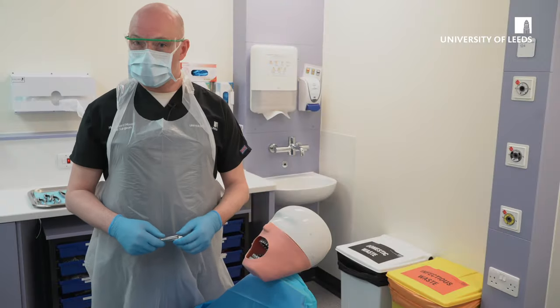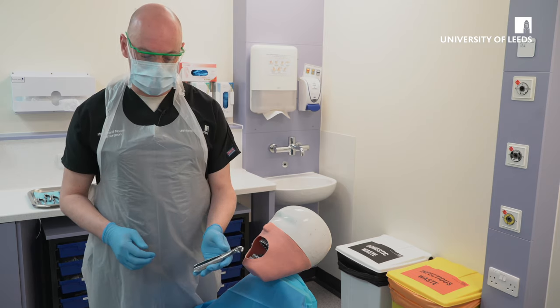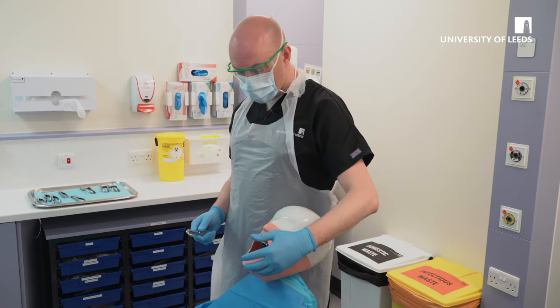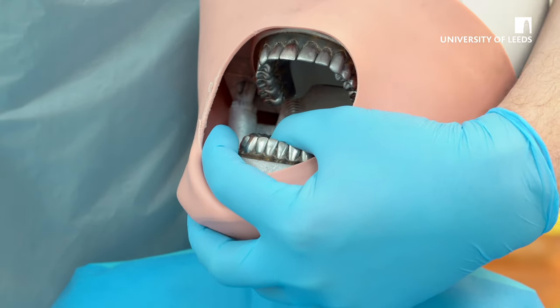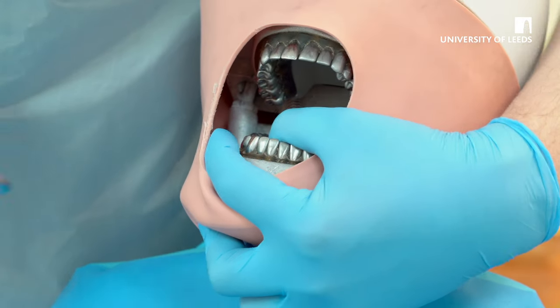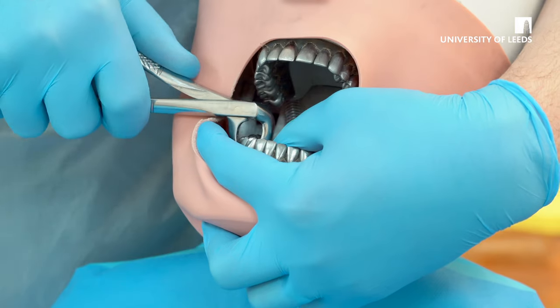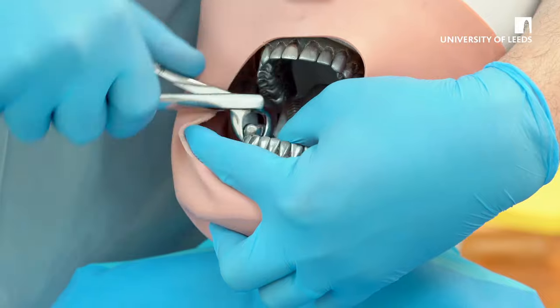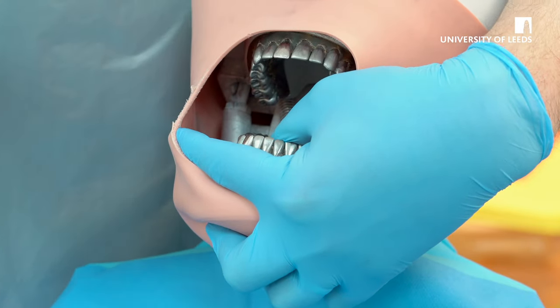To remove lower molar teeth, the forceps are universal, whether you're right-handed or left-handed. As a right-handed operator, for lower right extractions you want to be stood behind the patient, with your non-dominant hand supporting the mandible. Ensure that your thumb is lingual, your fingers are buccal and underneath the mandible. The forceps need to be opened, placed on the correct molar tooth, driven down apically, and then a figure-of-eight motion to expand the socket, and then deliver the tooth buccally. Ensure that you check the apices once it's been extracted, and squeeze the socket.